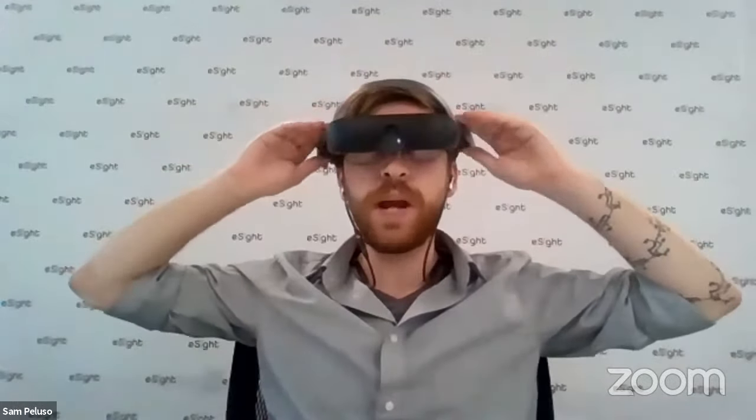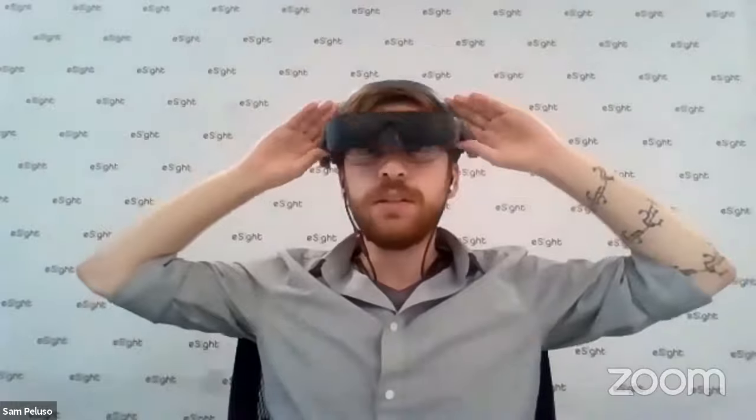Yeah, so the weight of the battery in the back is offset by the weight of the visor in the front. Exactly, that's the whole idea behind it. We had a lot of problems with the eSight 3 and eSight 2, where especially if it was hot, it would slip down your face and all of the weight would end up on your nose. Totally, and that just doesn't happen with this. This one just stays in place the whole time you're wearing it.